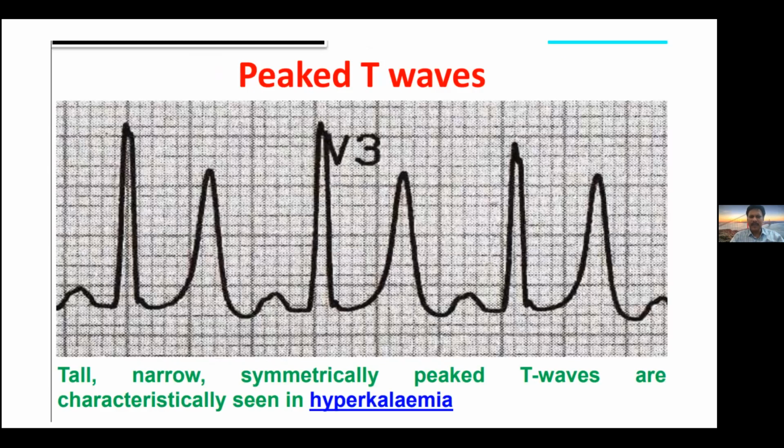Peaked T waves. See here it is peaked, tented, the ST segment is present, narrow base, tall T, and tented T, and the apex is very peaked. Then it is simply hyperkalemia. You look at this ECG, you will never forget hyperkalemia.